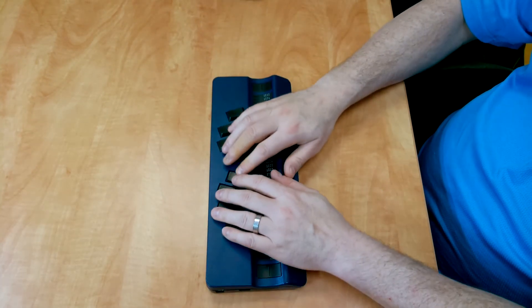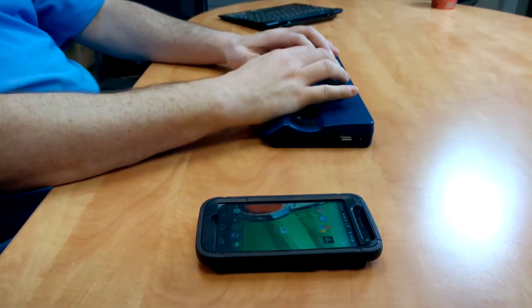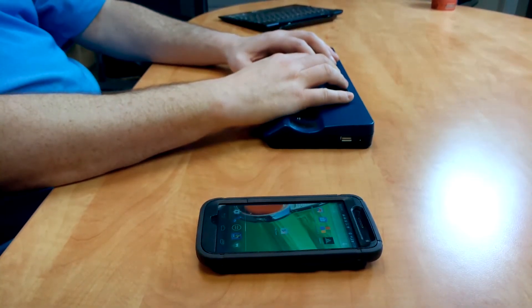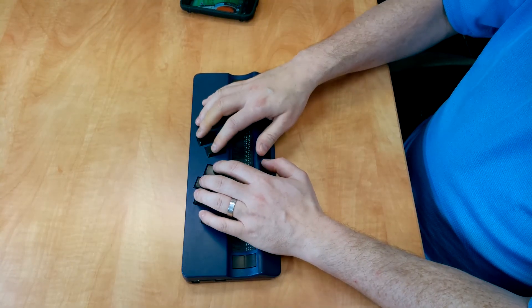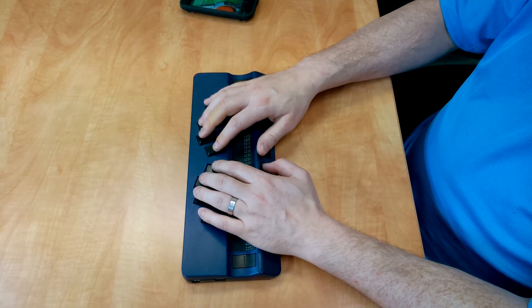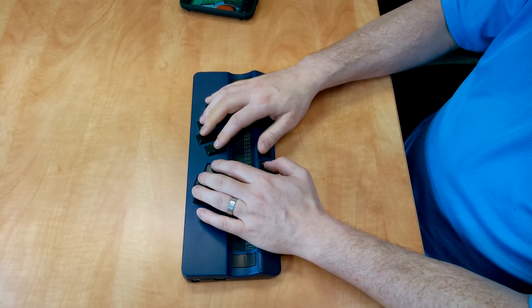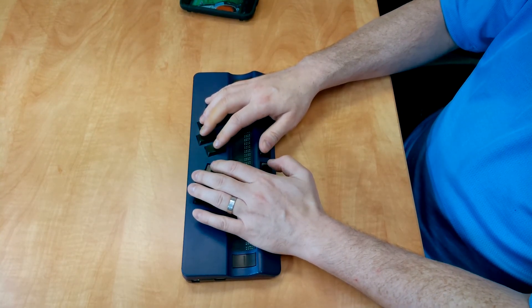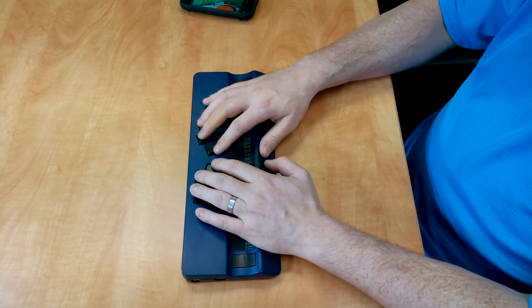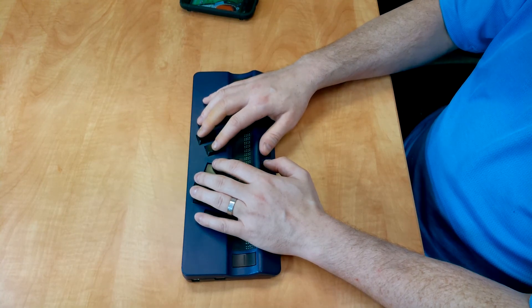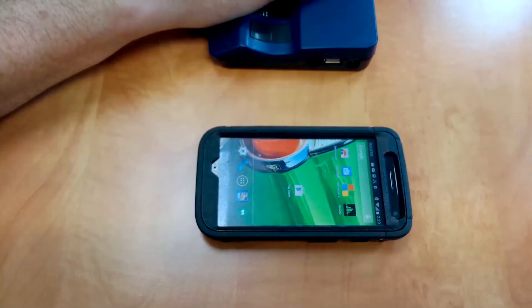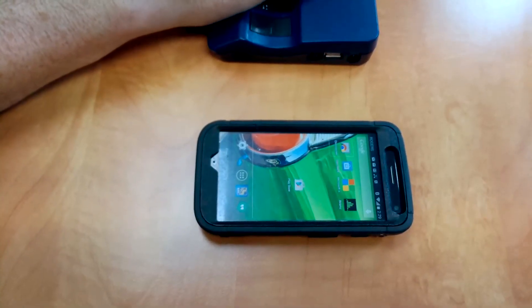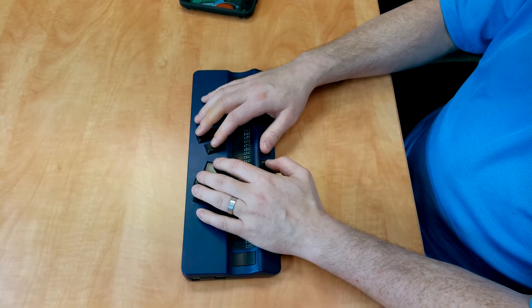So if I press the letter H with the spacebar, you hear my device say Home. If I press dot 1 in the spacebar, it should move up. It tells me there's nothing at the top. If I press dot 4 in the spacebar, it moves down to Chromecast, which is my next option.